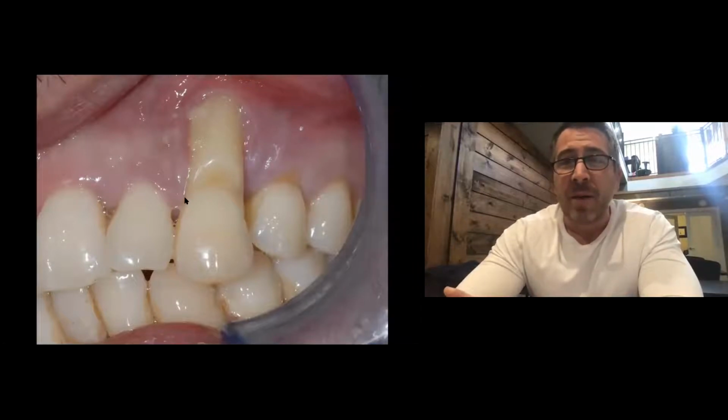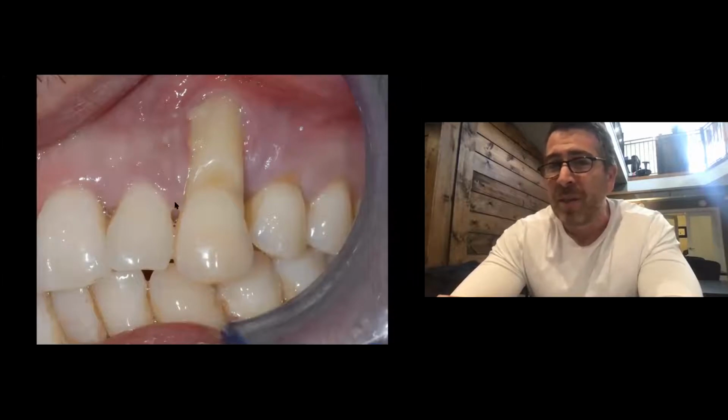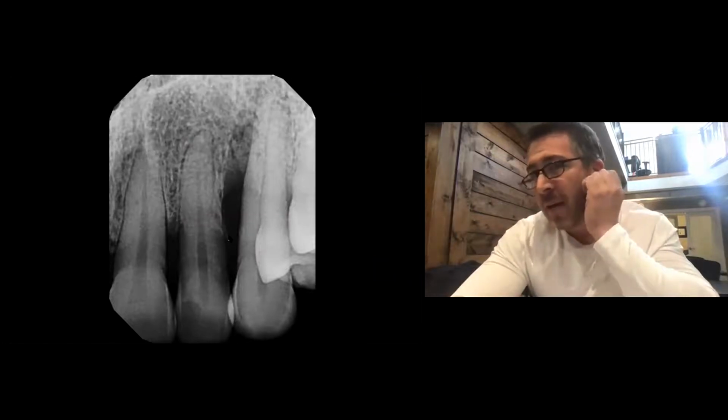So when we look at the radiograph, we want to look at where the height of bone is because we have to advise the patient that when I do surgery here, I run the risk of losing your papillas. So we look at the radiograph and you can see that the height of bone that's on the distal of that lateral is not in a good position. So I already know when I sacrifice this tooth and I improve the periodontal situation of this area that we're going to lose papilla in that spot.